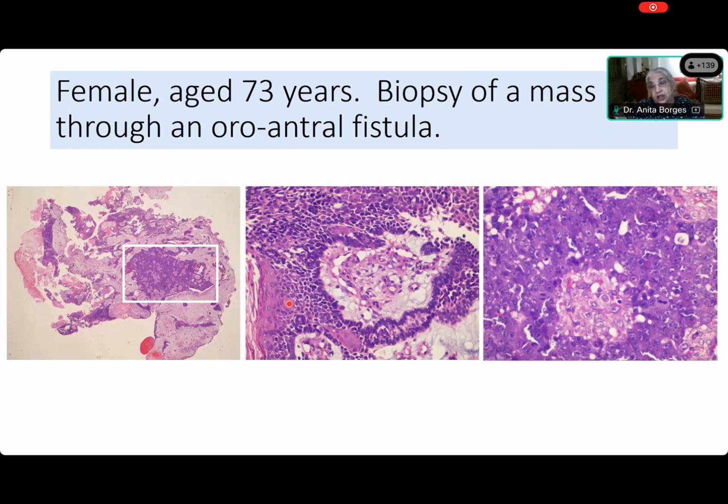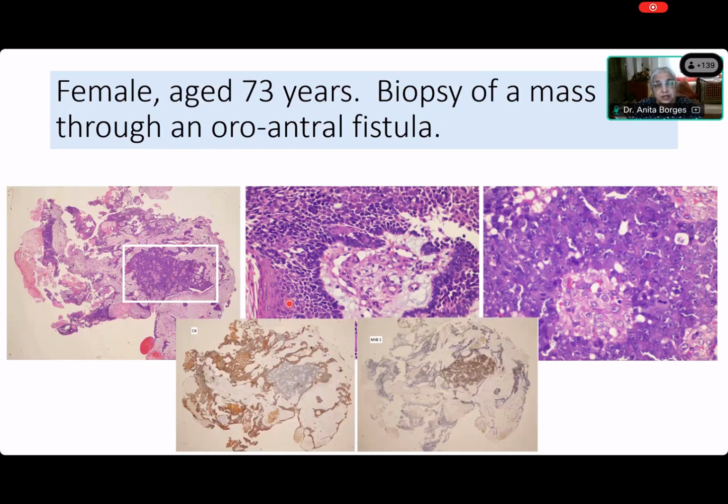And that ameloblastoma, which is so beautifully differentiated, and you can see in the middle over there, this has gone under high-grade transformation. You can see that the CK is present everywhere except in that region, and the MIB1 is low everywhere except there. MIB1 is the proliferation index, and it is high only in that central portion of the tumor. This is dedifferentiation in an ameloblastoma. So we would call it progression or high-grade transformation of an ameloblastoma that is dedifferentiated.